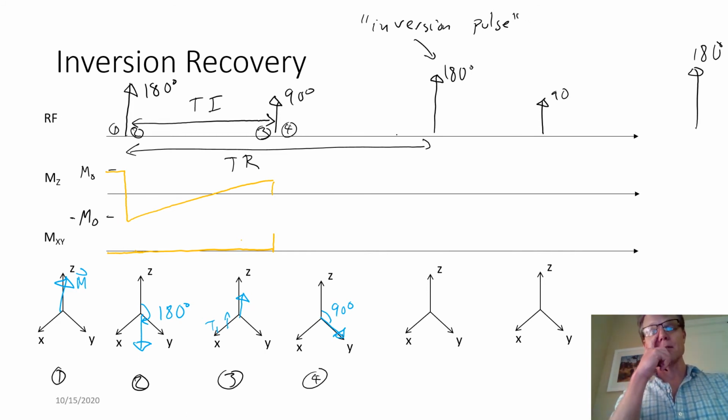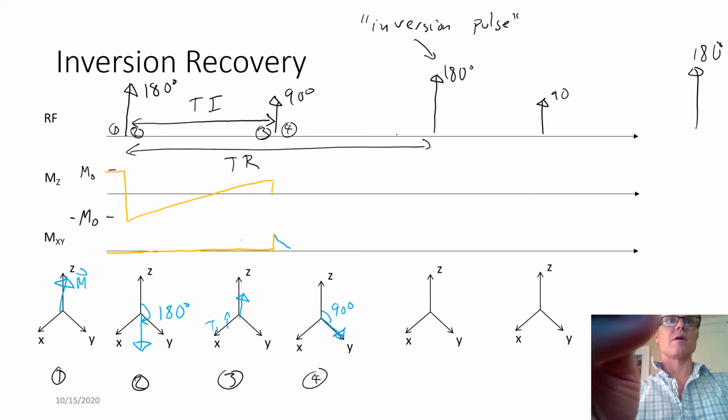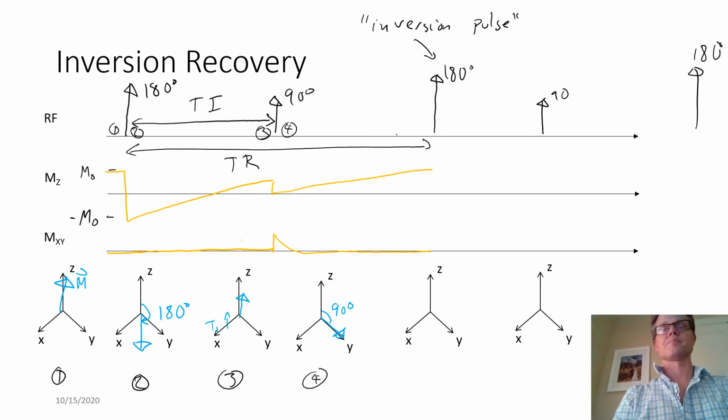And then, once again, we have relaxation that occurs after the RF, T2 decay, and then T1 recovery.